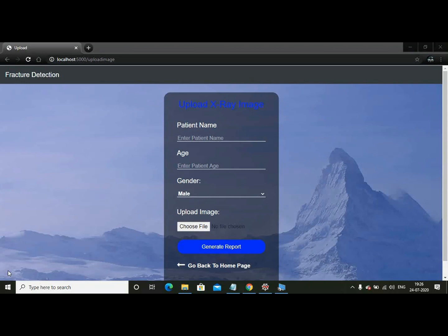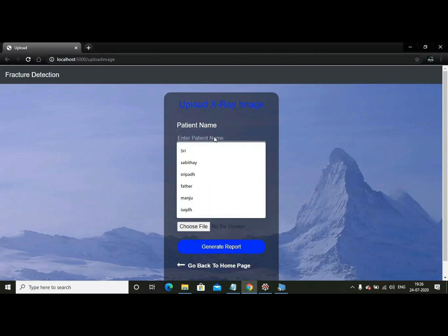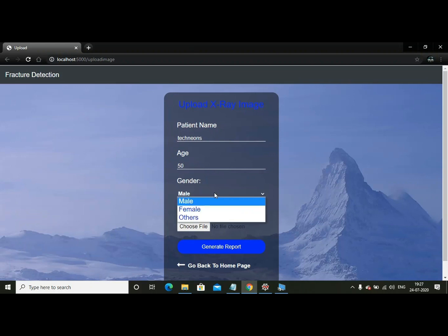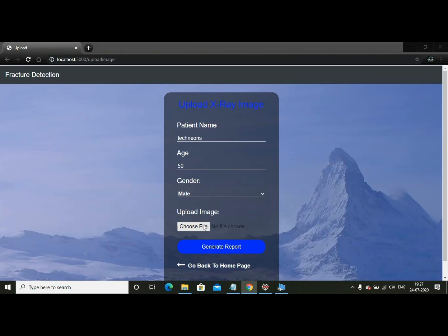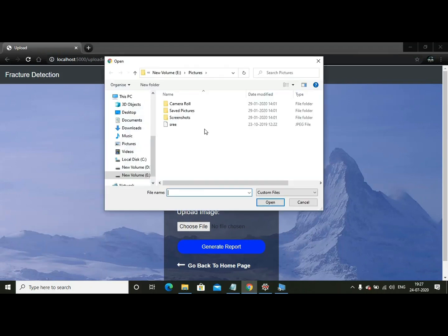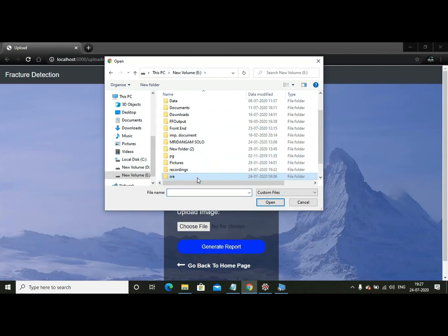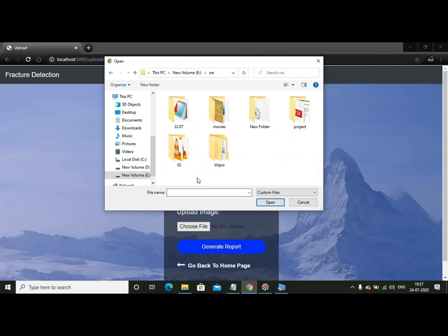I have skipped the routing part as it is unnecessary and showing you the image uploading page. Here, the patient is going to enter his name, some Technions, and then his age, randomly some 50. Let's keep it as male. Now choose file. Now you are going to upload your file. Let us take from my validation set.